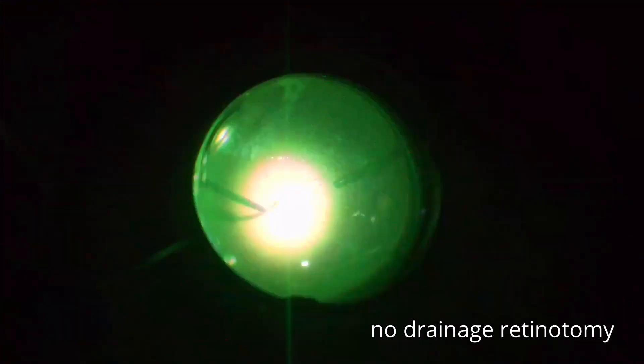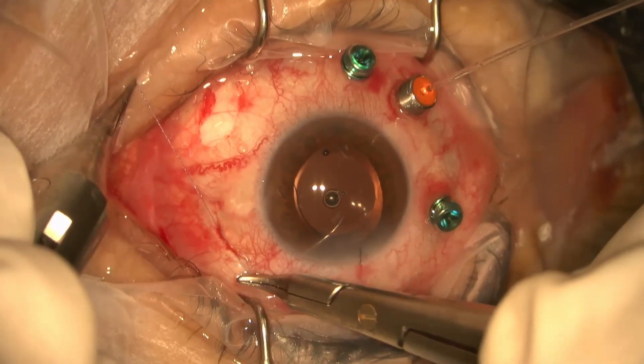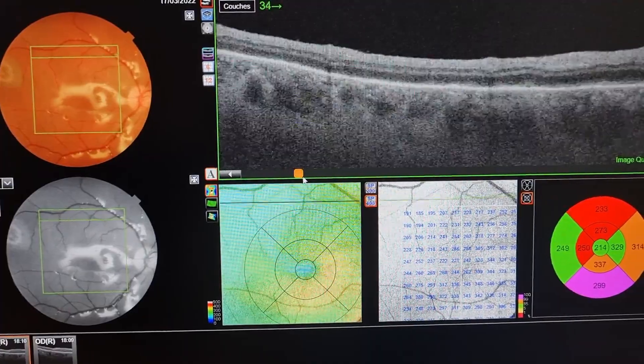Under silicone oil, a micro tear is laser treated also. These are releasable sutures and this is the conclusion of the surgery.